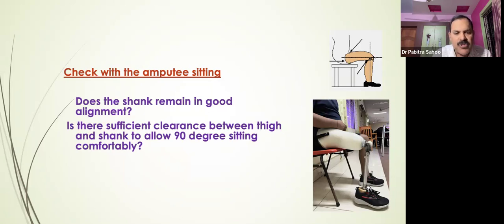If the prosthetic knee is lower, then the thigh component will protrude out, like here in this case. If you look at this joint and the knee, the mechanical knee is protruding forward in comparison to the anatomical knee. And the shank appears smaller than on the other side.